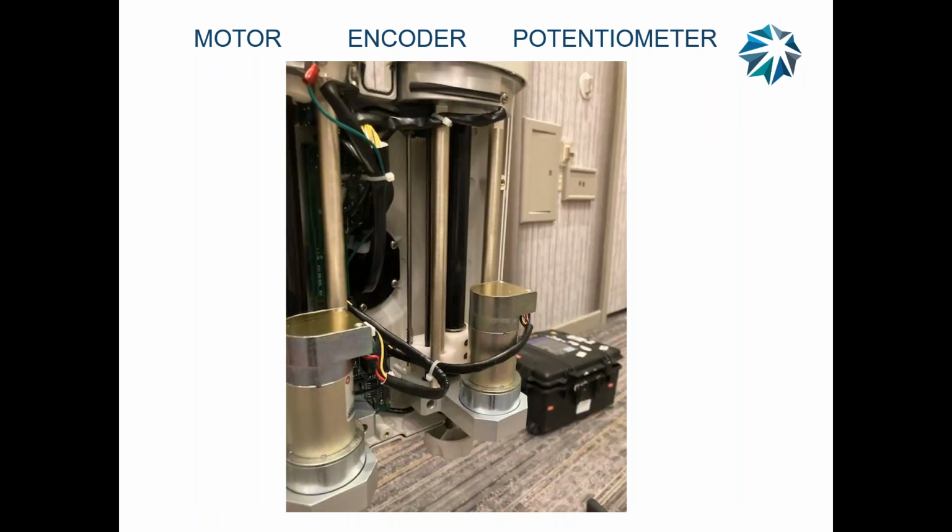And we just went over the CVI. And that's the CTA. There's the linear pot right there. It goes up and down. As the piston goes up and down, they have a wiper that goes up and down on that piston.